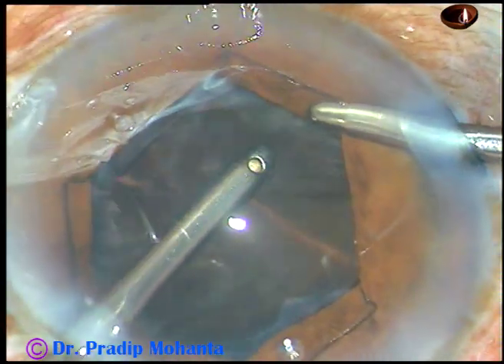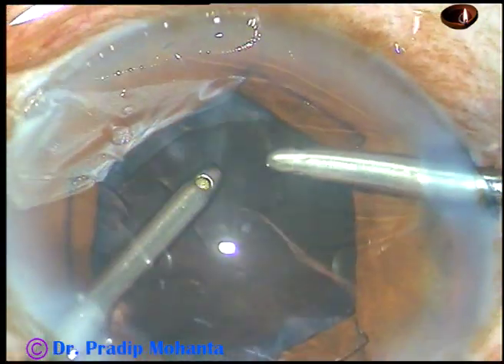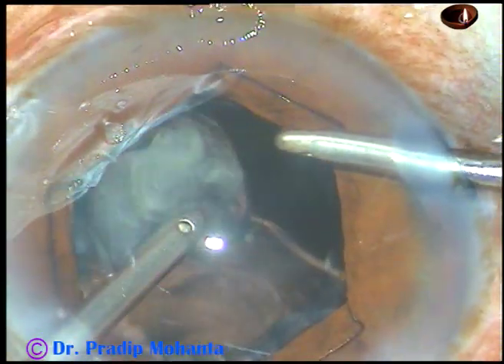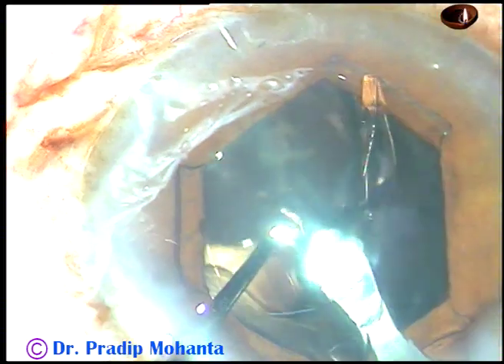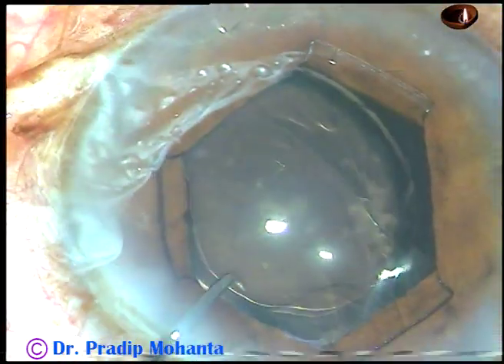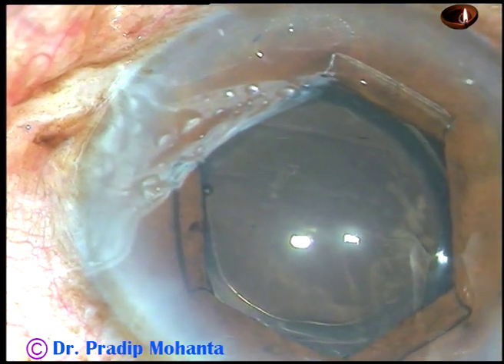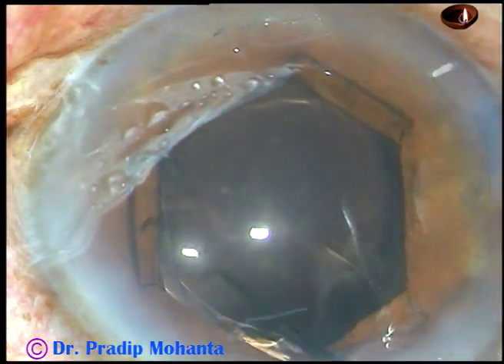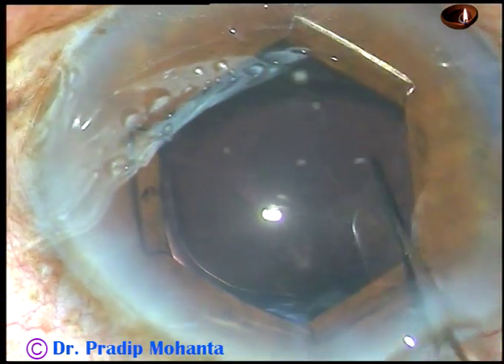Then the cortical cleanup is done by bimanual irrigation-aspiration. After cortical cleanup, viscoelastic is injected into the anterior chamber, and a foldable intraocular lens is placed in the capsular bag. The lens is dialed such that the haptics are about 90 degrees away from the main wound.